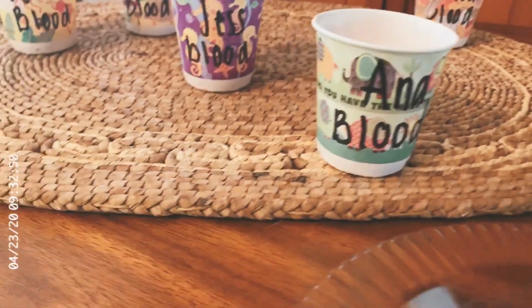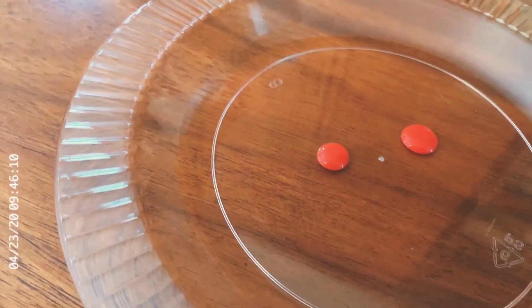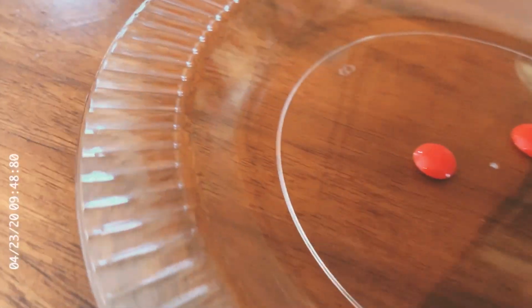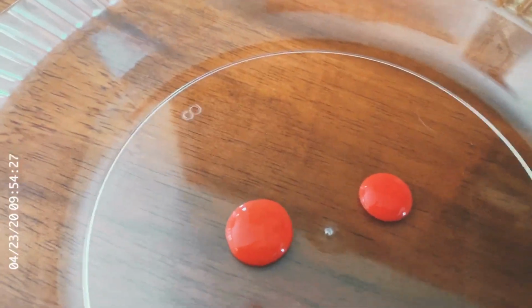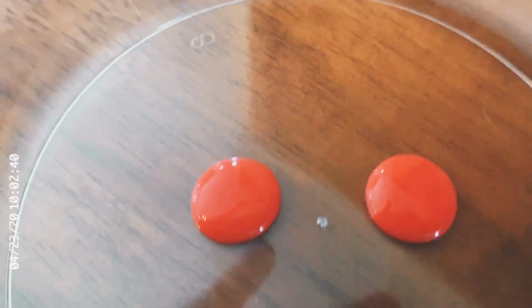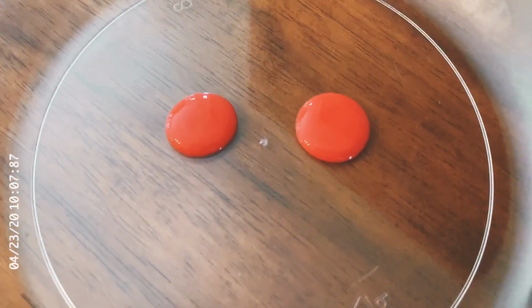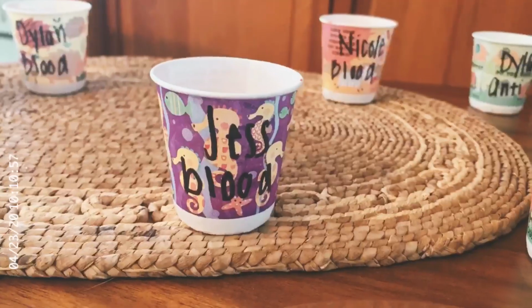On to the next. Let's test Anna. We'll get some of her blood. 2 drops of sample on our plate. Cleaning out our medicine dropper. And we're going to go into her anti-A and anti-B. Here's her anti-A. Cleaning out our medicine dropper. Here is her anti-B. We're looking. Go ahead and write down your positives or your negatives for Anna. All right, we're halfway there with the family.